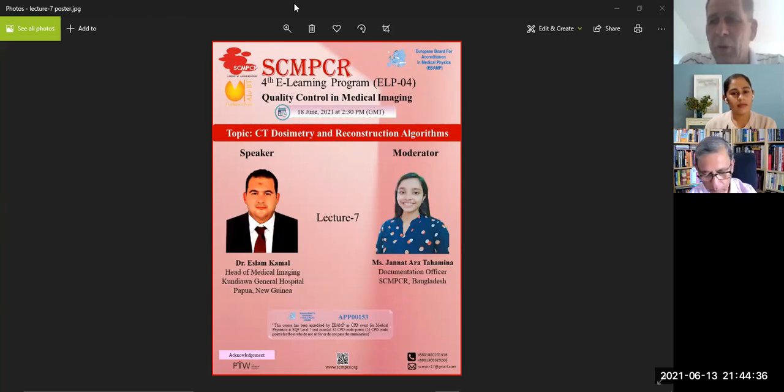I would call it a virtual machine, close to the clinical machine but not for clinical use. You can use all the parts used for clinical use, but with more flexibility over kV and mAs, so you can set those things manually and not have to use pre-programmed sets of parameters.